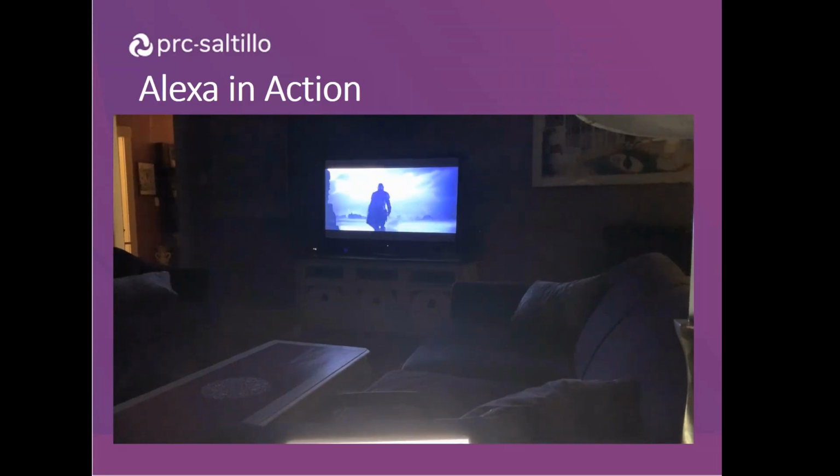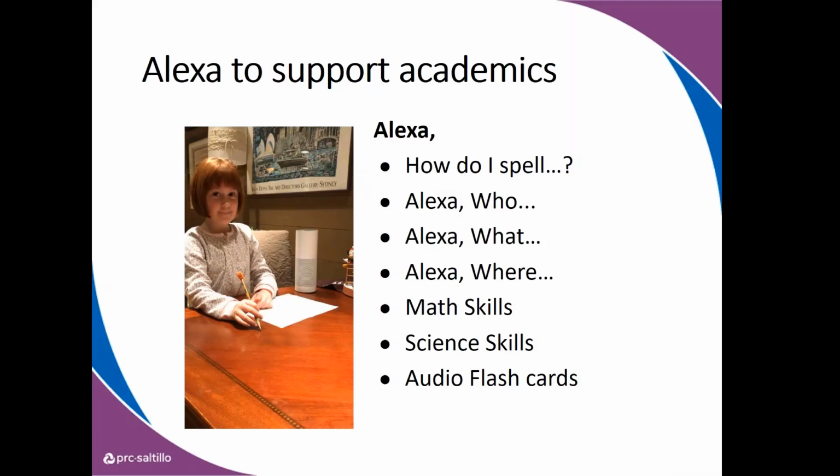Pretty cool. So that was kind of a quick thing. I could do any of those things without AAC, but I hope you got to see how quickly you could use AAC to do some of the same functions that you would just be speaking to Alexa. So whether it's asking for a mindful minute, turning on the TV, using a smart plug to turn on a light, asking for the news or the weather, or play your favorite songs.